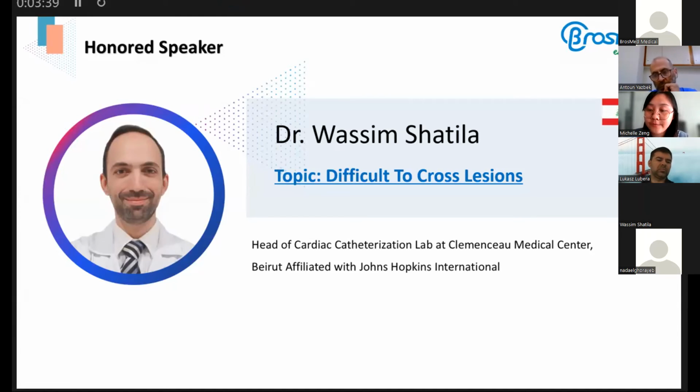May I have your idea for the practical clinical significance of Alveo, the ultra-low profile balloon, in CTO lesions? So I think the clinical significance is, as we said, in CTO lesions, first is to cross the lesion, whether antegrade or retrograde. After you cross the lesion with a wire, the game is not done because a microcatheter might help, but you also have to have a balloon crossing. If you go directly with a 2.0 or 1.5 balloon, sometimes you don't cross, and it will be very sad if you can cross the lesion with a wire but cannot cross with a balloon. That's why the ultra-low profile balloon is a stepway between crossing the lesion and advancing larger balloons.